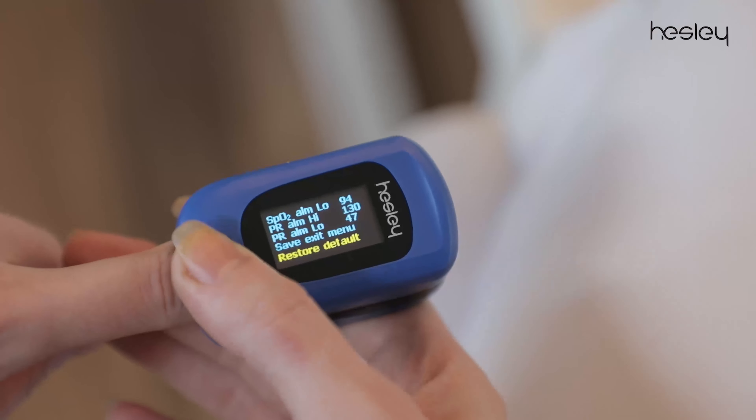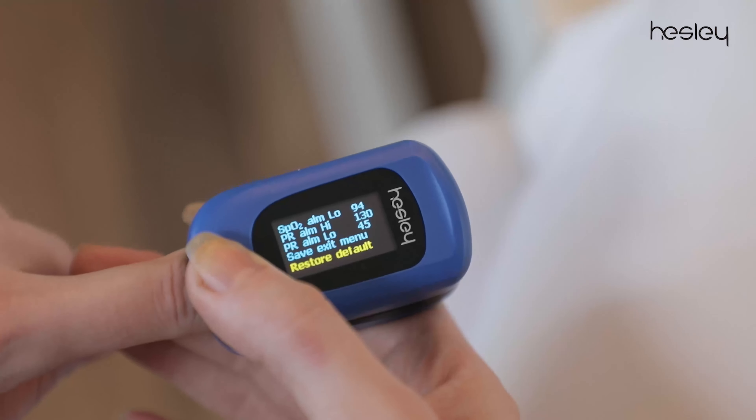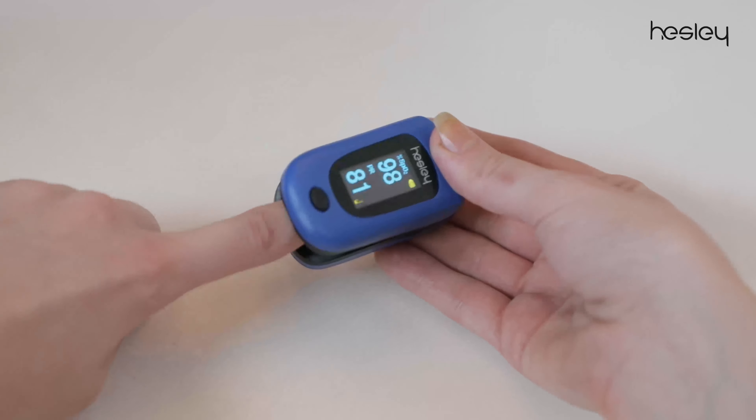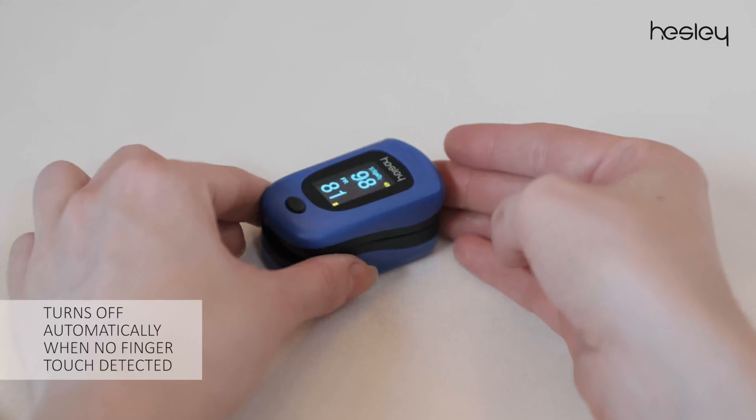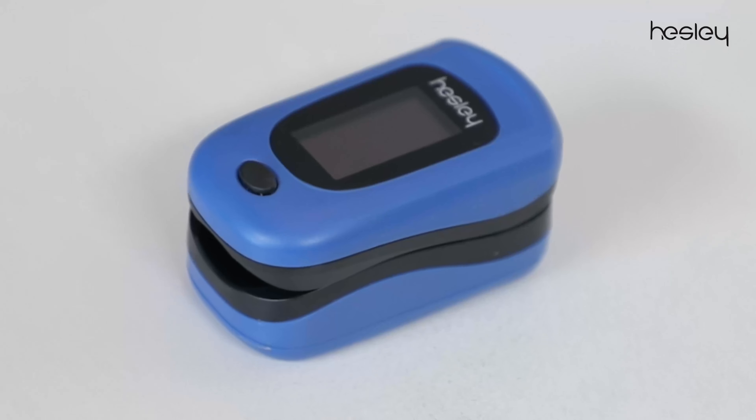If you wish to change a setting, short press the button until you arrive at that setting, then long press to adjust and save. Also, this smart fingertip pulse oximeter automatically shuts down to save power when there is no finger touch detected for some time.